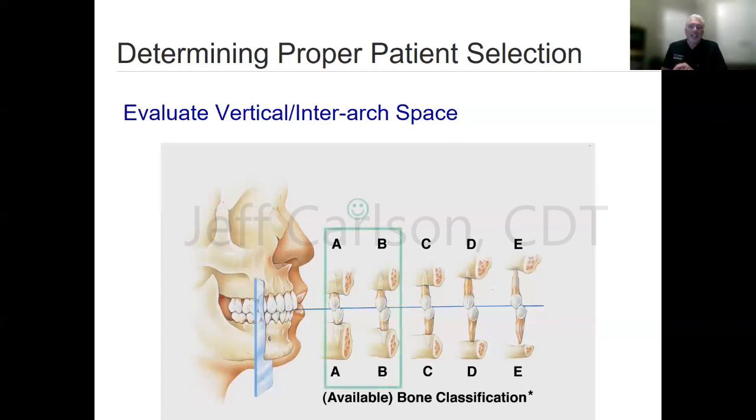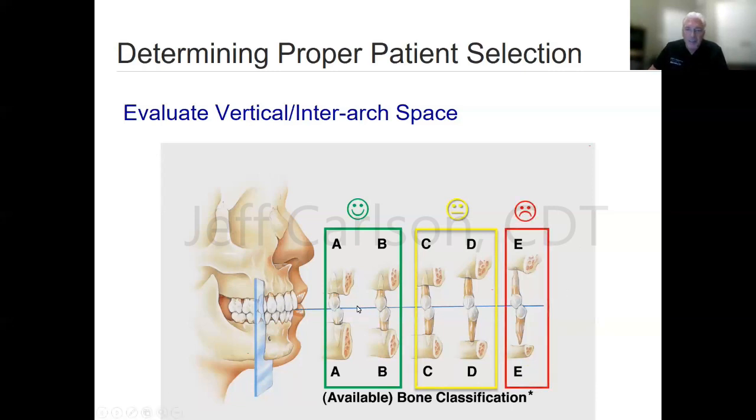So there's also been some classifications, just looking at this, where we don't change the plane of occlusion, this blue line, but when you have bone resorption, that's crown to implant ratio. It's crown to root ratio, but in our world, it's crown to implant ratio. And that ideally should be 1 to 1. If it's a 10 millimeter implant, the crown should not be much more than 10 millimeters. However, that all depends too on how wide the implant was, musculature, bone quality, opposing dentition, things like that.